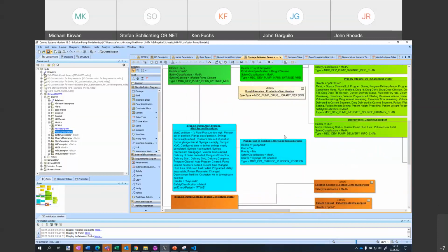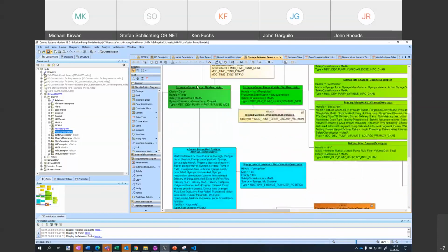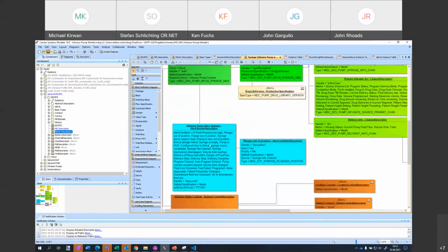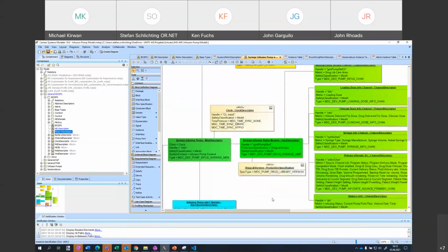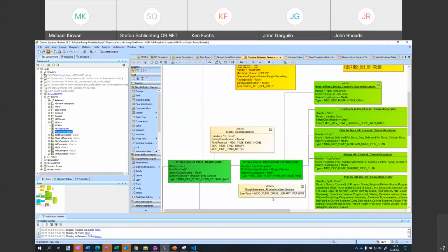Specific product. Okay, thanks. And then I did model also an alert system on MDS level with a lot of syringe-related alerts. And I did model only the conditions. I didn't model all the signals so far. And of course, we also created what we need for the patient context, the descriptors, and a clock descriptor.